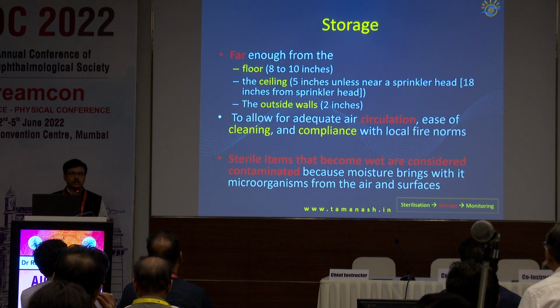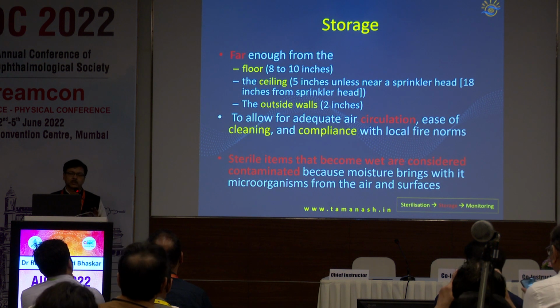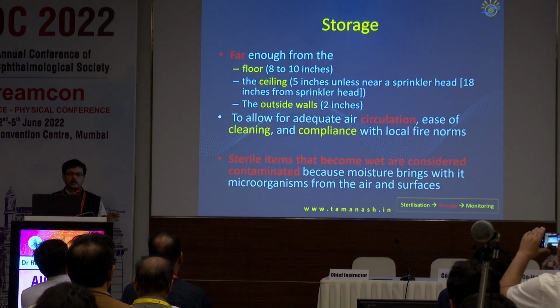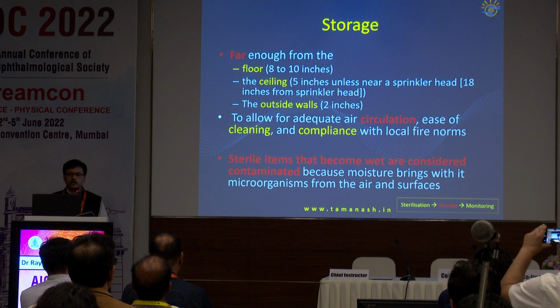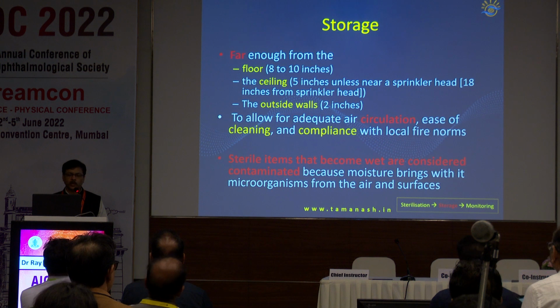Now about storage. This is often the most ignored part. We have a feeling that once autoclave has been done, everything is fine, so it can be placed anywhere and it can be opened and used at the time of surgery. Now ideal places of storage should be far from the floor, ceiling or outside walls, and there should be adequate circulation and cleaning and compliance with the local fire norms.